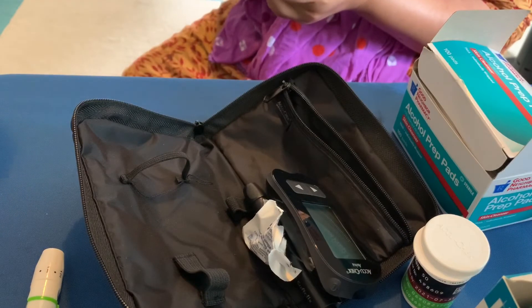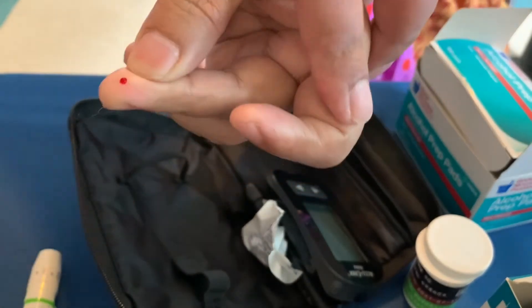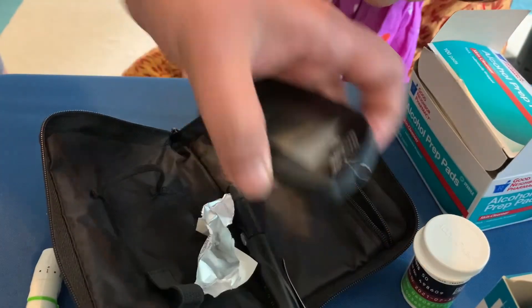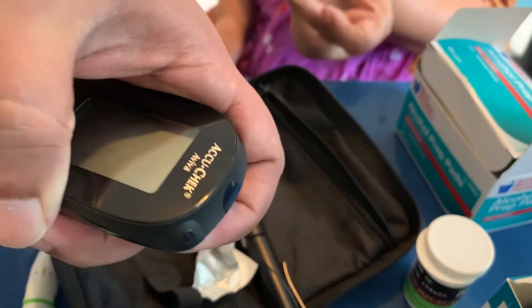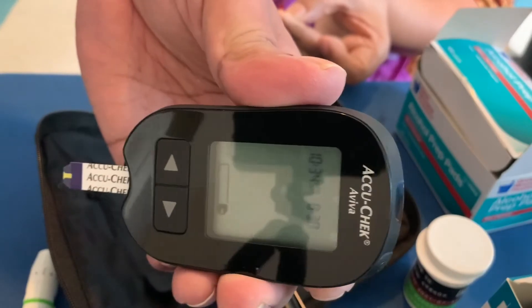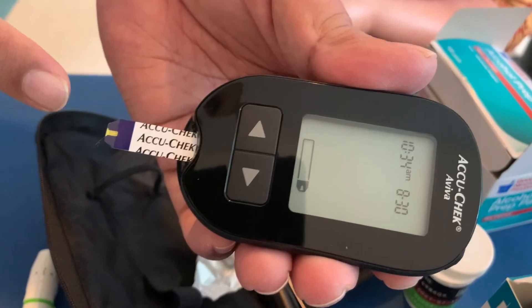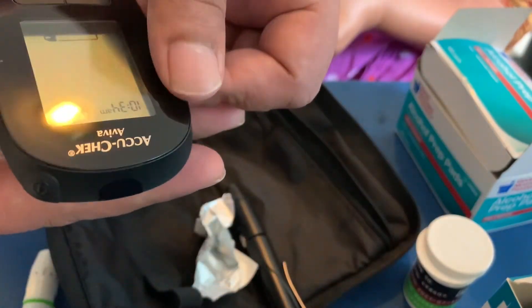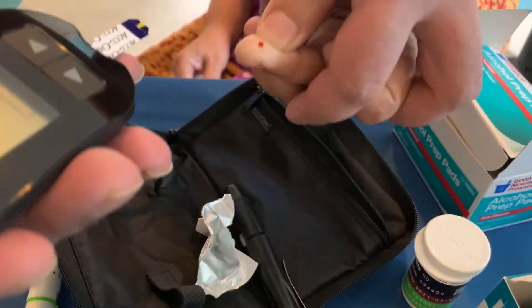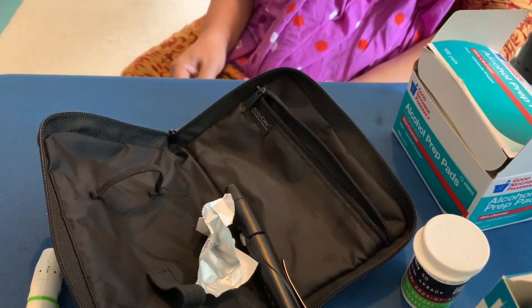You want to make sure that your meter is ready. I'm going to insert this test strip inside of the meter. Now you are going to touch and hold this part to the drop of blood, just like this. Once you do that, you are done — it will show you the blood sugar count.